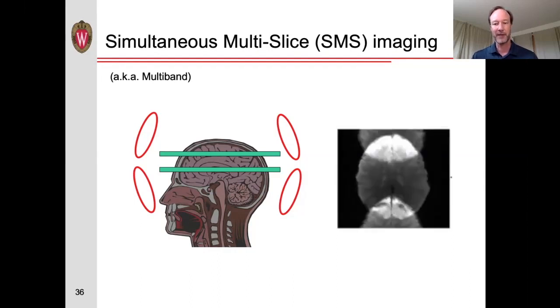Now, one additional modification we can make is to add some additional pulses to cause one of the slices to be aliased. And in that case, you can see that they're also in the image separate from one another, and this aids in terms of unwrapping these 2 images. And again, we would see the differences in the intensities based on the differences of these 2 coils.